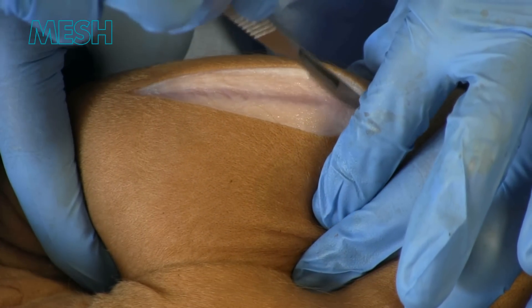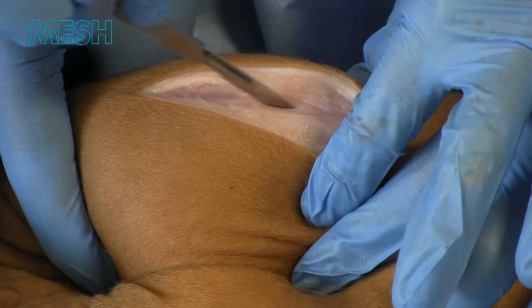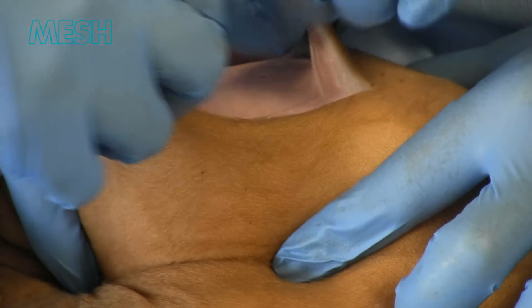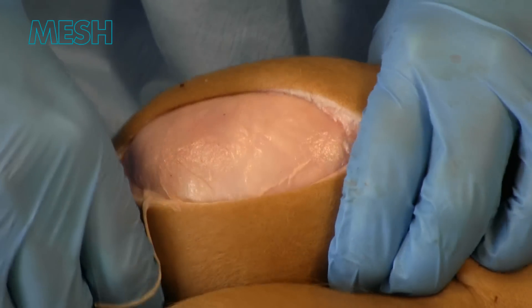Following skin, we incise DARTOS, which gentle retraction allows the fibres to split. Blunt dissection here allows delineation between DARTOS and the tunica vaginalis, which is seen to surround the testicle.